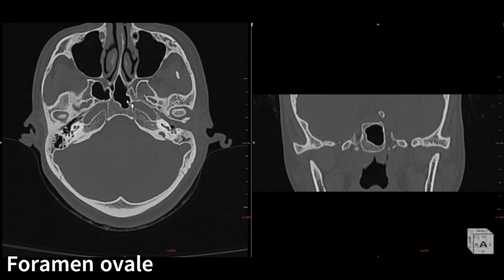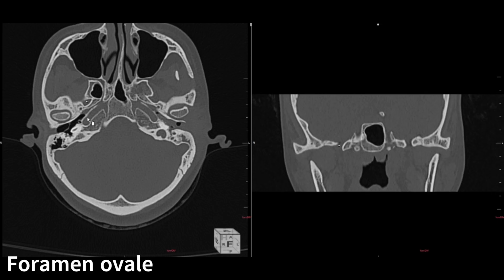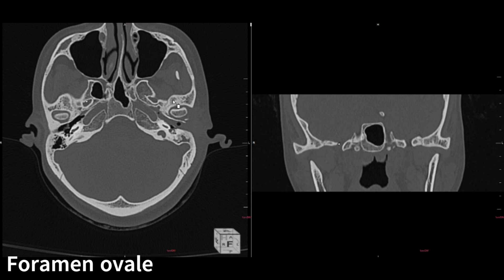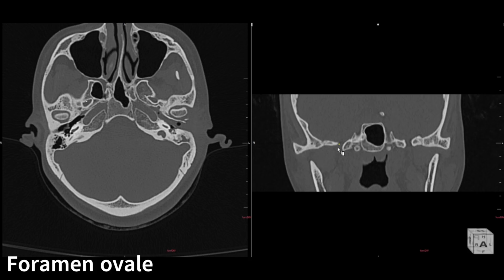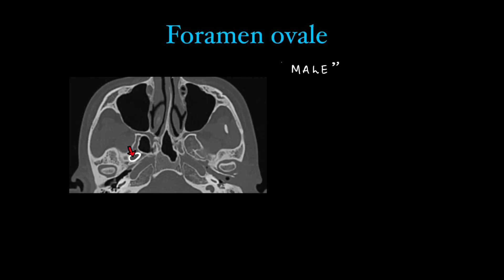Next we move on to the foramen ovale. Adjacent to the carotid canal and vidian canal, this is the foramen ovale — an oval-shaped foramen as the name suggests. On coronal images it is very well seen. Contents: there is a mnemonic — MALE structures pass through it.